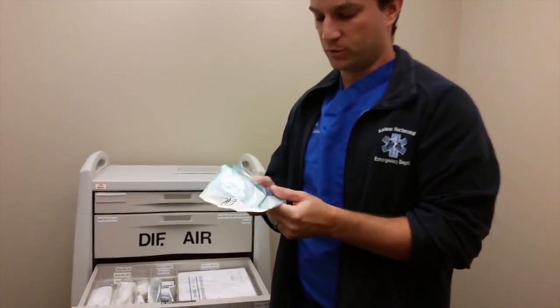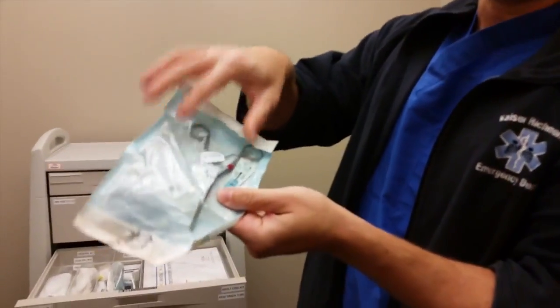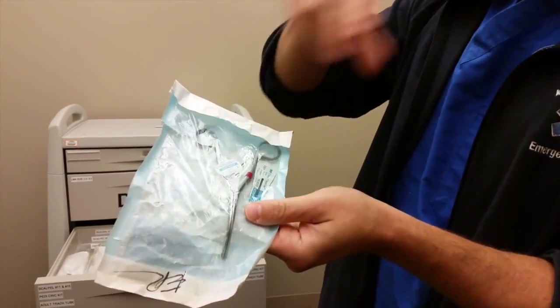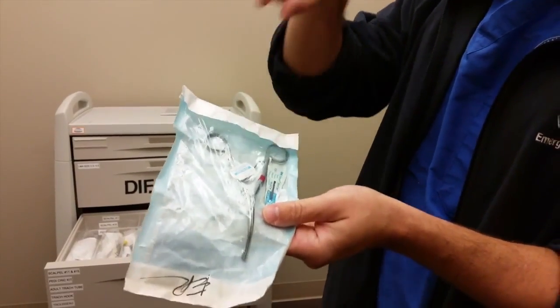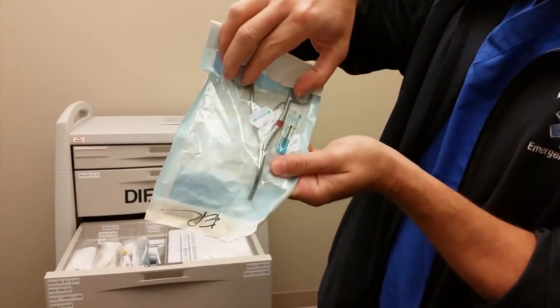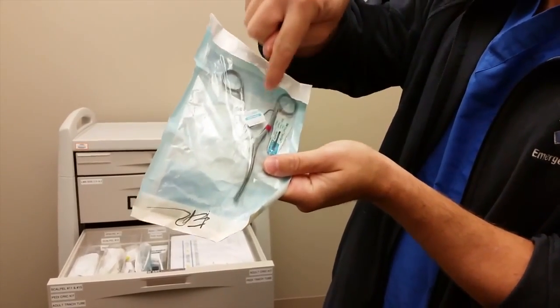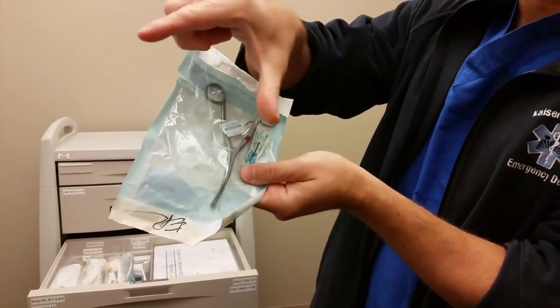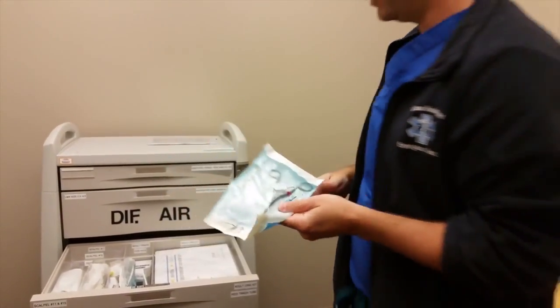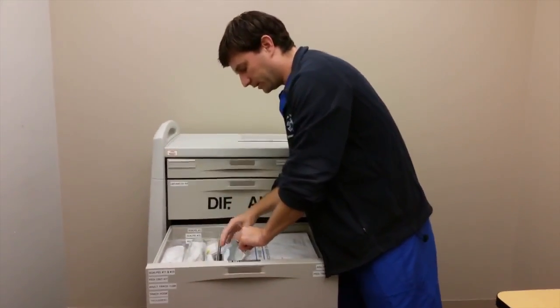And this is called a trousseau dilator, which will open up the tracheal inlet. Sometimes if the tissues collapse or whatnot, and you've got the hook in there and you can't see where you're going, you can stick this into your surgical site and open up the tissues by squeezing it. And it's got a lever here, and then these distal prongs open up, so you can spread open your field and see what you're doing. That's the main stuff in here.